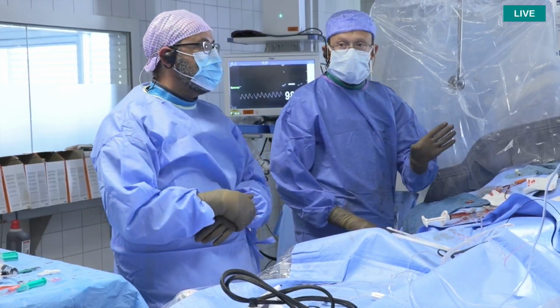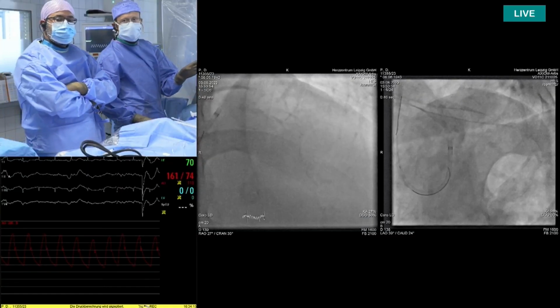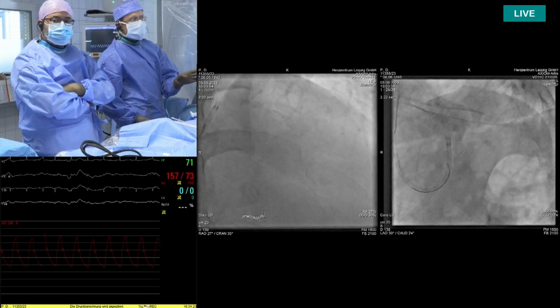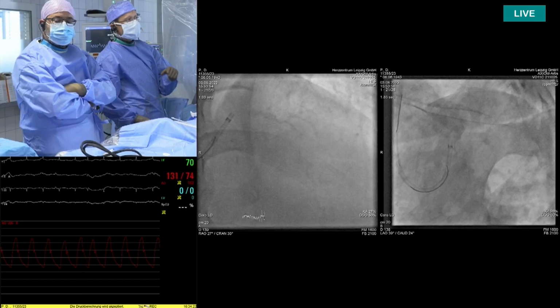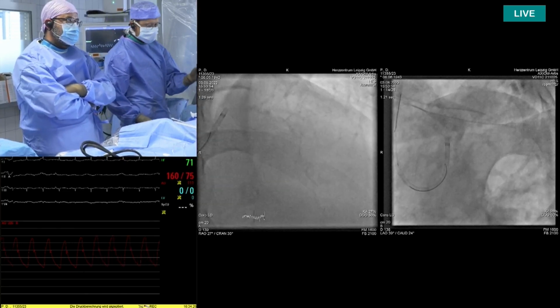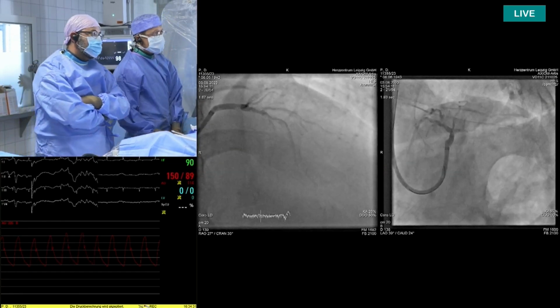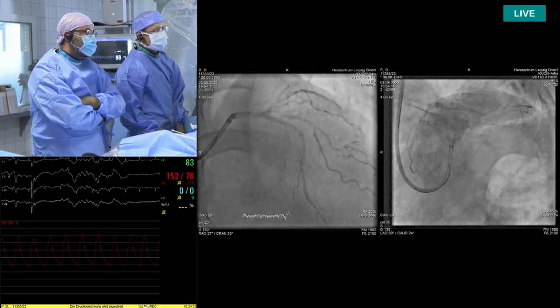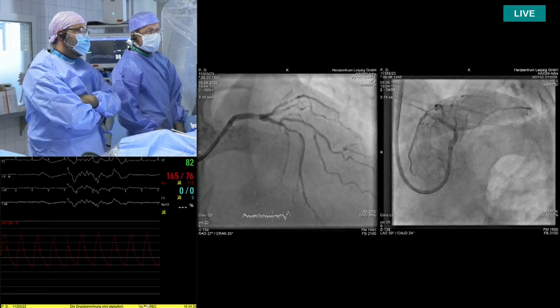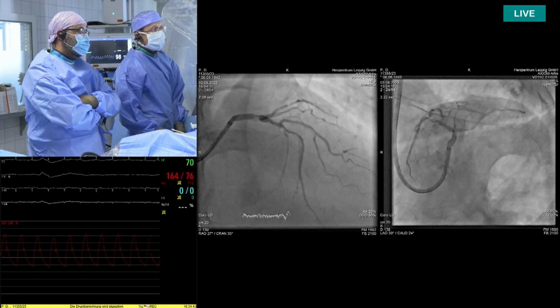Go ahead. First of all, I would like to show you a couple of images. Can you see this X-ray image, this angio image? Even without imaging, it's obviously severely calcified. Left main bifurcation and LAD diagonal bifurcation. You can see calcium without any contrast. And in the next image, you can see the anatomy of the bifurcations. It's a quite long, severely calcified lesion involving two bifurcations, and we hope that the ostia of the circ and of the diagonal are not involved in the stenosis.